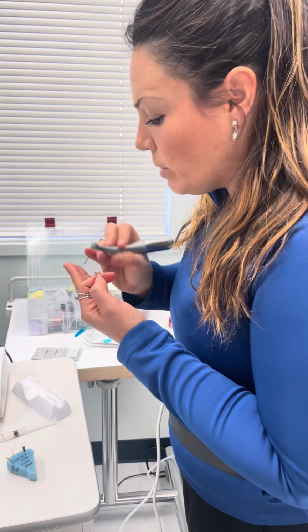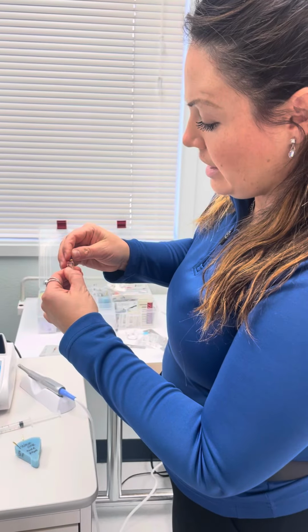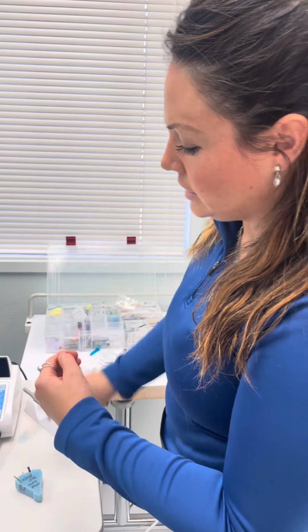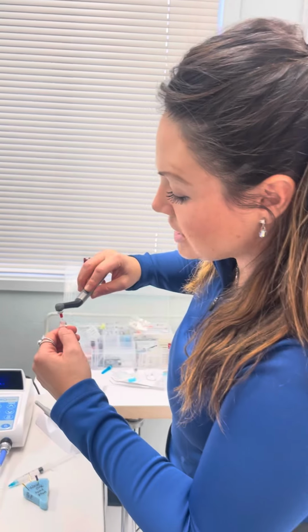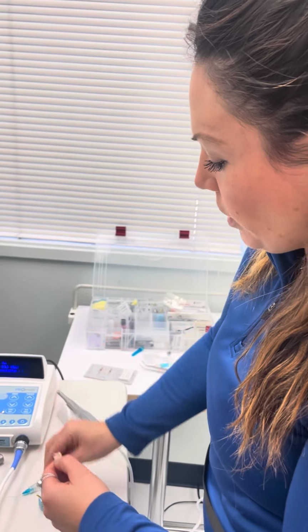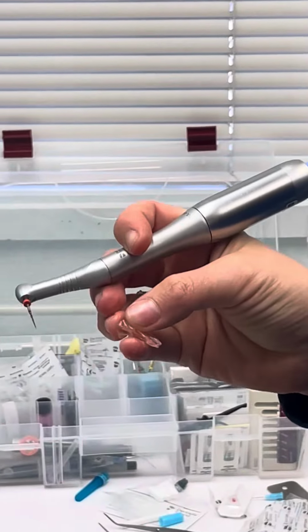Check, make sure it wasn't a file thing. File looks good. At that point, I do say just go ahead and make sure we don't have anything causing you to do that. Nope. The apex is still free. All right, let's get out whatever's in there. Blockage is 90% of the time why you get misreadings. Okay? Irrigate. And then let's go ahead and try to work it again.